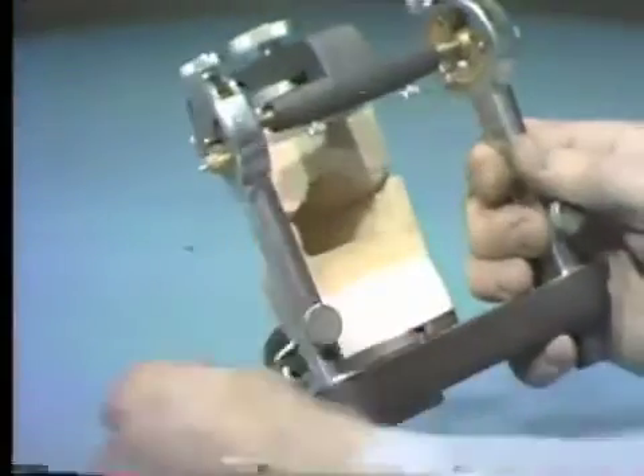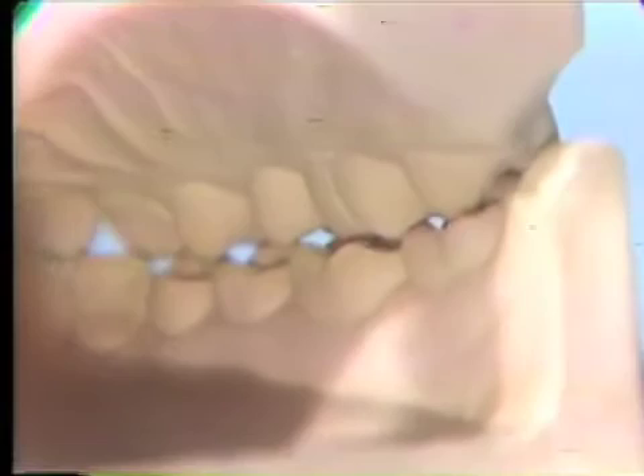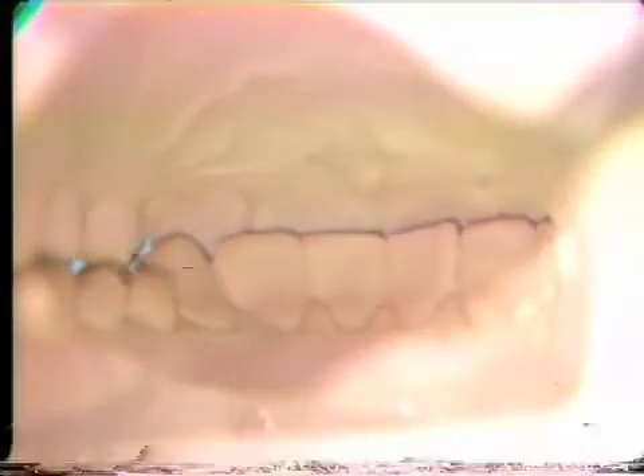To examine exactly where the maxillary supporting cusps contact in centric, the casts are viewed from the lingual while lightly tapping the teeth together. Observe the location of the centric stop for the distal lingual cusp of the right maxillary first molar. Maintain the centric stop during the functional waxing exercise. Careful examination of how the maxillary supporting cusps move in and out of centric occlusion is not possible during the clinical examination. If narrow strips of shimstock are used to check individual maxillary supporting cusps for contact in centric, the accuracy of placement can be verified from this view.